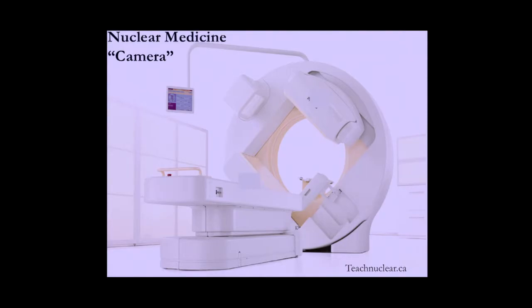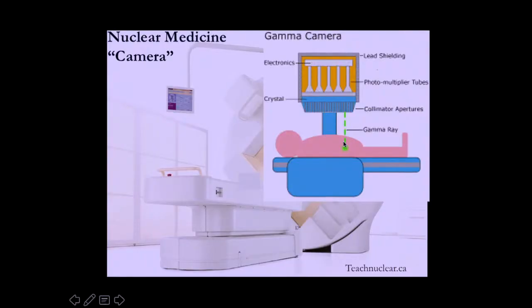Now, these cameras are very different from what you've seen. This one, you'd be hard-pressed to figure out what the heck it is, but this is a big detector. There's another one underneath the table over here. This is an image receptor, and this is a low-dose CT scan. So this is two cameras in one. It's a nuclear medicine camera and a CT scanner. And I'll talk about this in more detail. Now, inside this thing, well, first of all, I have to have a patient with something in them. If I put a patient on the table, you get nothing without the isotope.